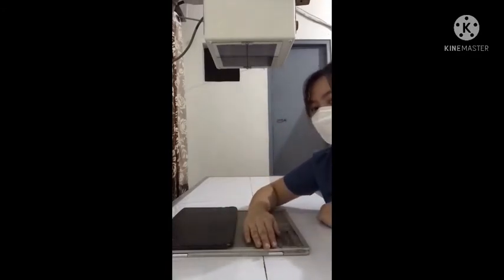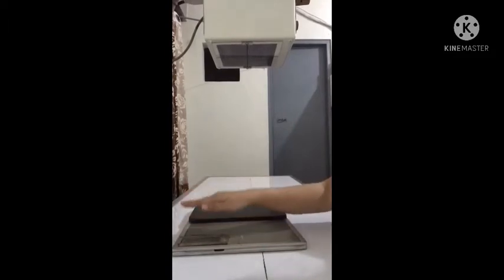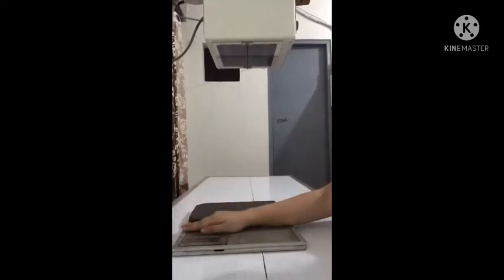Flex the digits so that the wrist joint will be placed in contact with the image receptor. Here's the difference of not flexing the digits for wrist PA projection. You can see that there's a gap under the wrist area when the hand is positioned with its palmar surface down. When you flex the digits, this gap will be lessened and the wrist will be in contact with the image receptor.